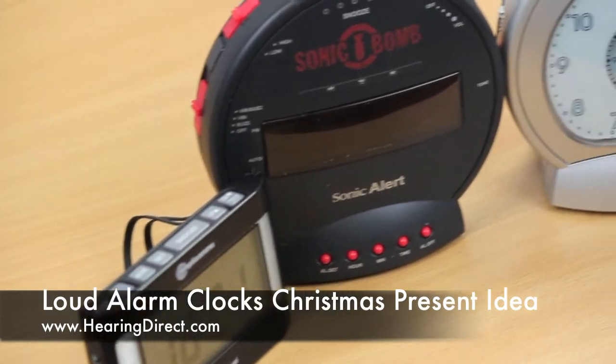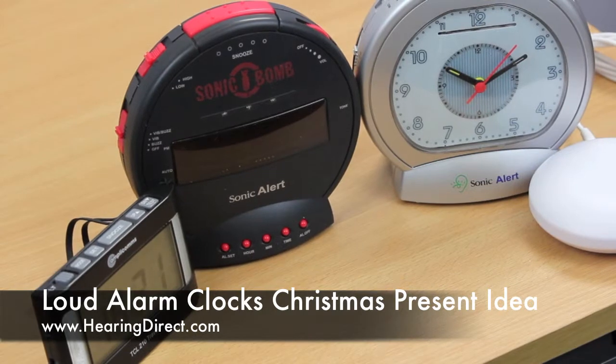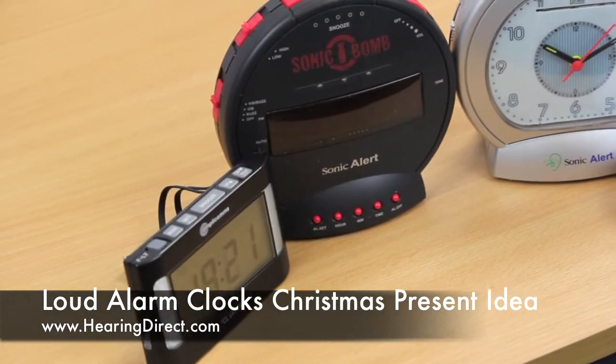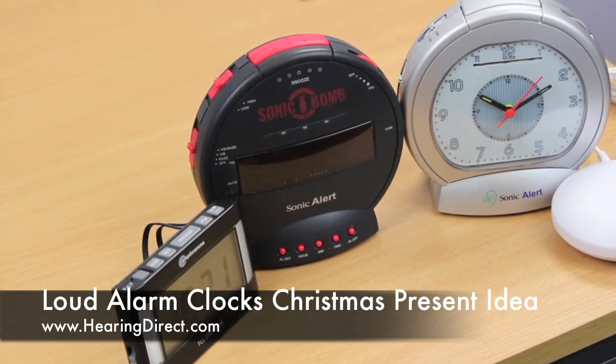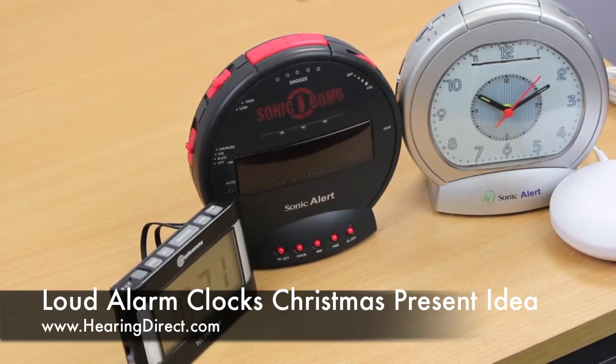There are different options to consider. The two different manufacturers that we use are Amplicom and Sonic Alert from G-Mark. They come in a variety of different styles, as you can see, and a selection of these three will hopefully give you an idea of the kind of options that we have available.